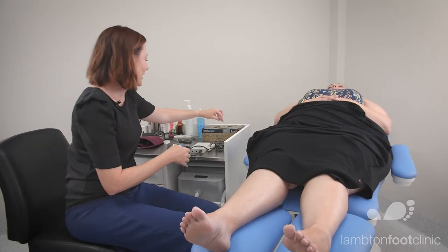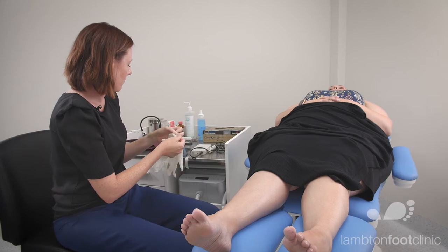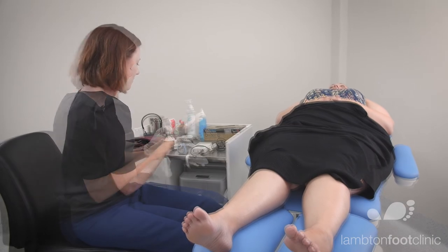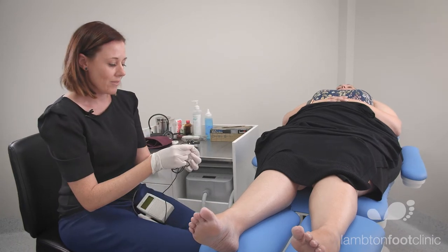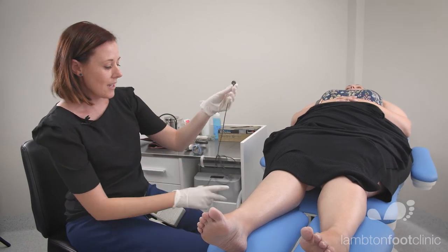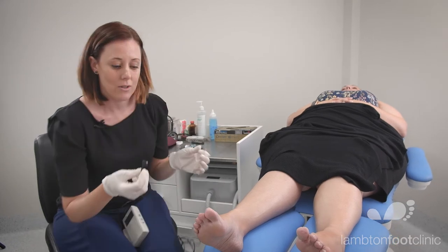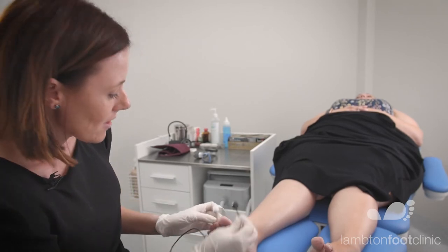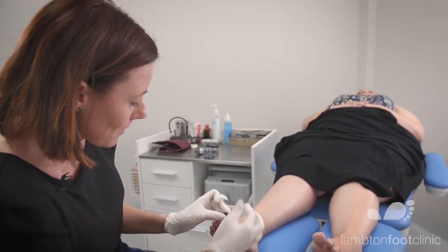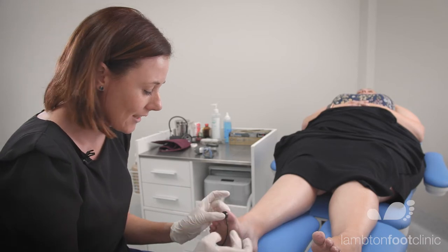So I'll start by putting my gloves on. So the PPG probe will have a glass side or a glass face. We want that side to be in contact with the skin. So that should be placed on the distal pulp of the hallux so that no light can get in.